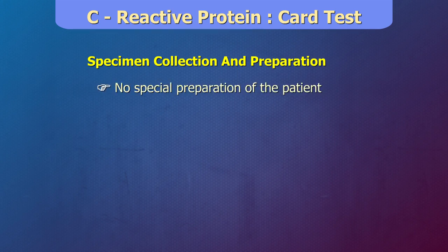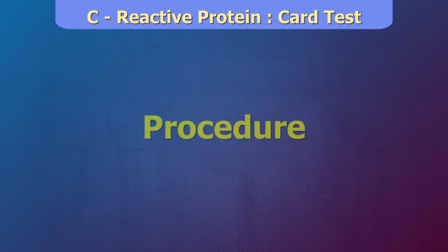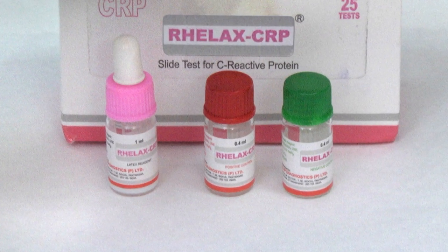Specimen collection and preparation. No special preparation of the patient is required prior to specimen collection by approved techniques. Only serum must be used for testing. If a delay in testing occurs, store the sample at 2 to 8 degrees centigrade. Procedure: bring reagent and samples to room temperature before testing.